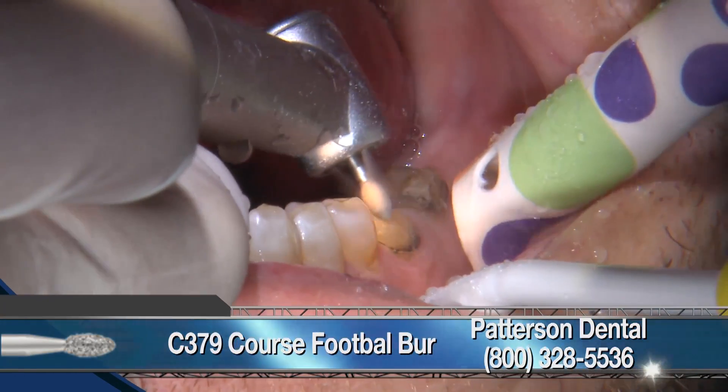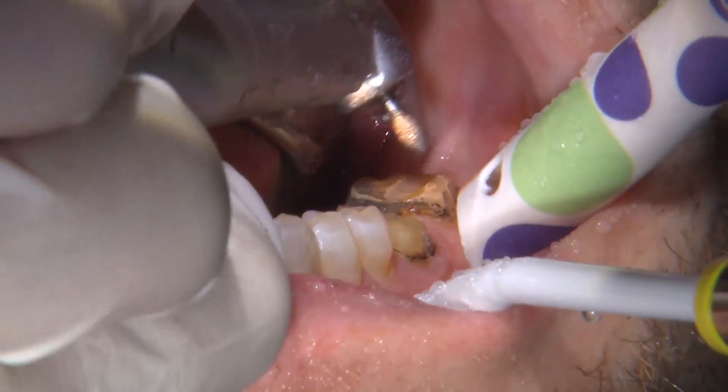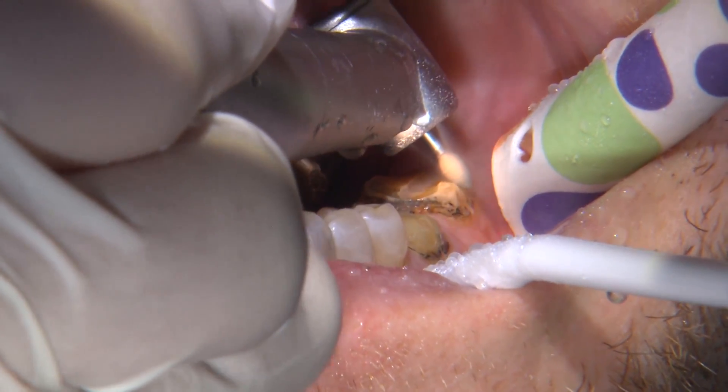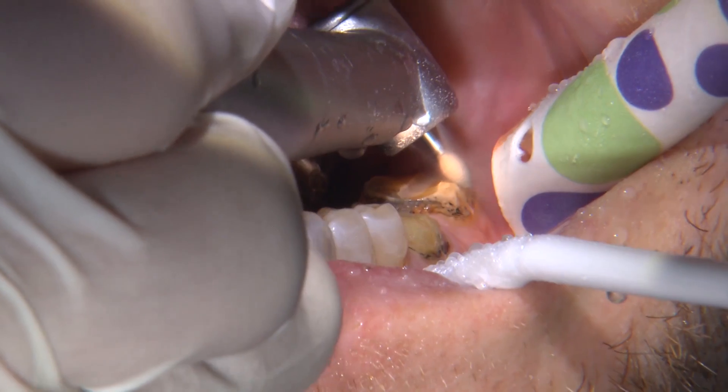We are using an all-ceramic restoration for this case, so ideal reduction occlusally is one and a half to two millimeters. I do use a prep check guide that shows me what areas need to be reduced even further.